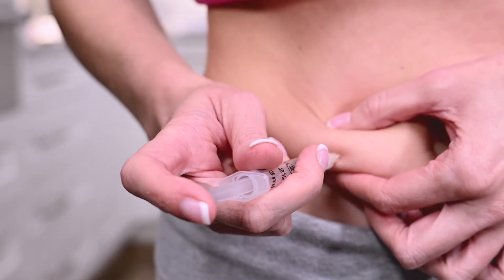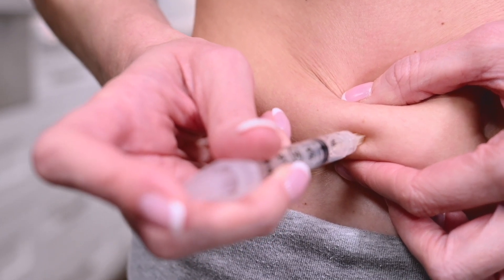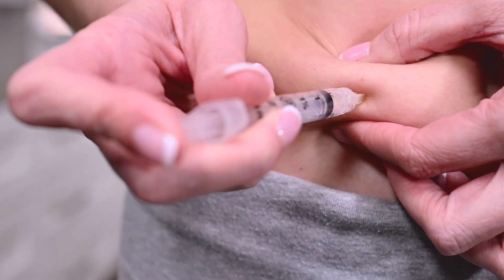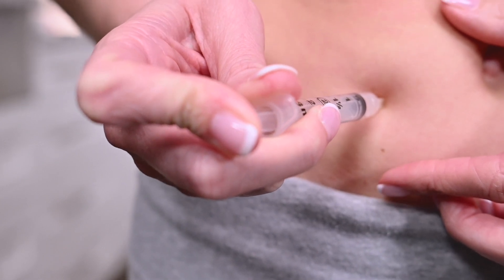Take the syringe in your preferred hand. Pinch a fold of skin between your fingers and insert the needle at a slight angle. Release the skin after the full length of the needle is inserted. Push the plunger until all the medication is administered into the injection site.